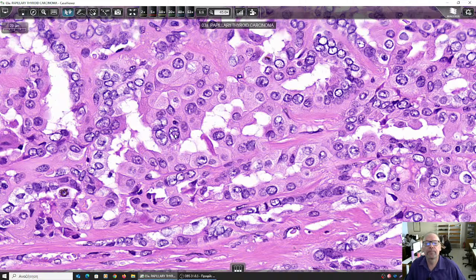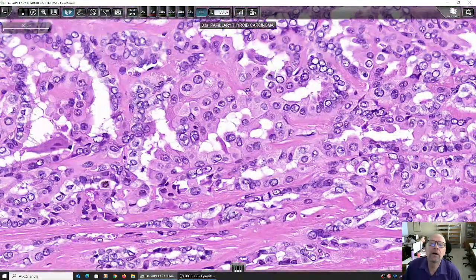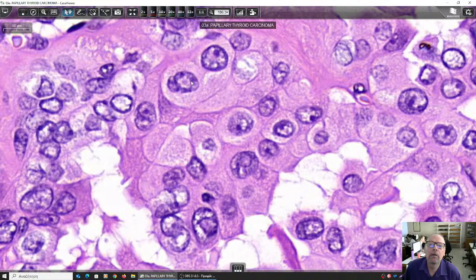What is this? This is a cytoplasmic projection in the nucleus. This is a nuclear pseudoinclusion. Very typical. You see, this is the nucleus, and this is the inclusion. The nucleus and the inclusion. Great. Another one. This one. Look, there are too many. Here they are. You see?